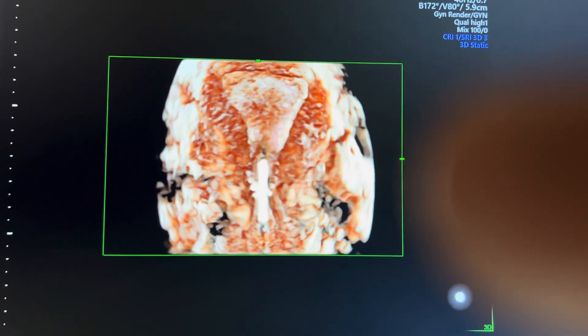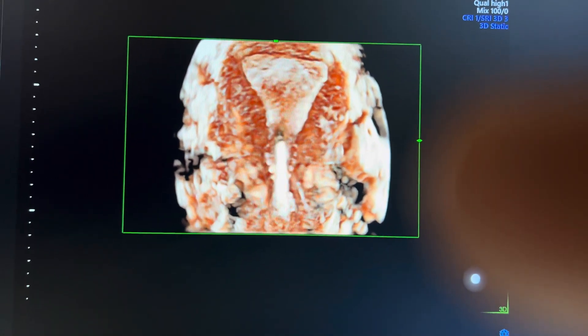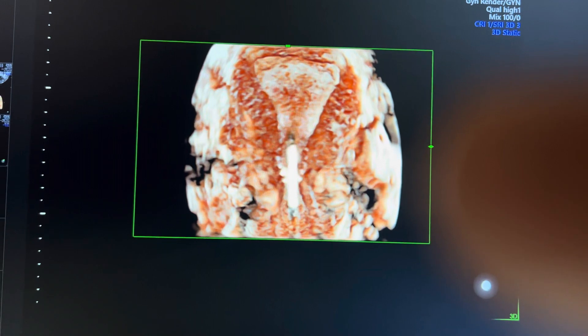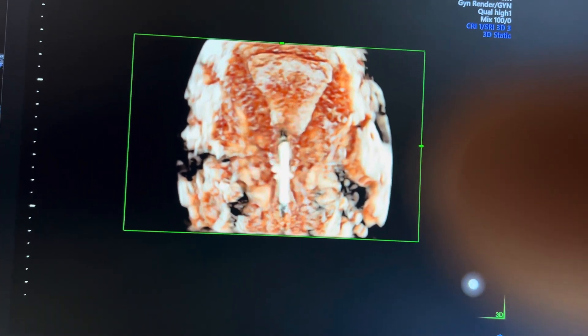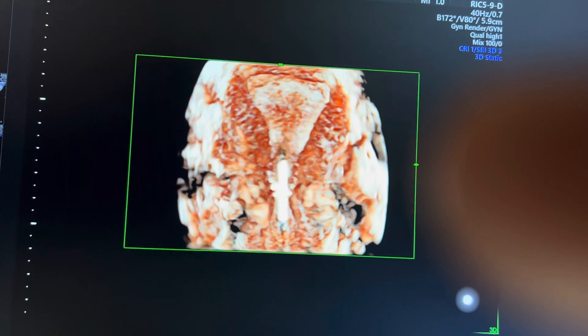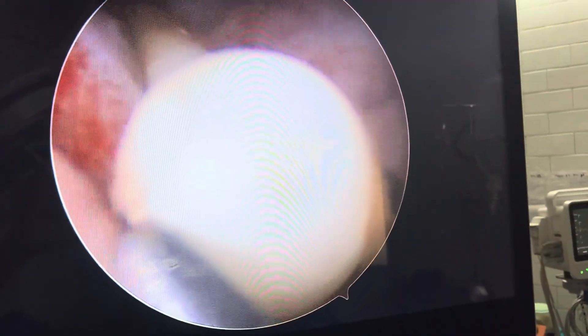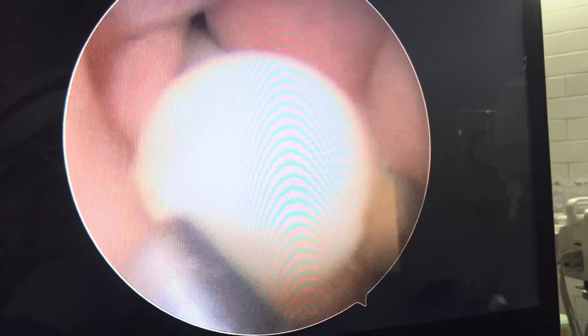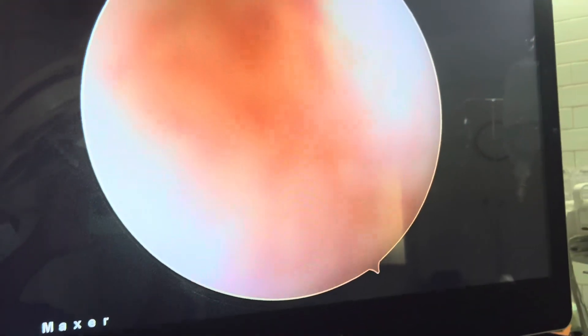This is a 3D image of a postmenopausal patient who has a copper T which is displaced downwards, and she has spotting per vaginum. This is the hysteroscopic picture where I'm trying to remove the IUD with a grasper through the hysteroscope.